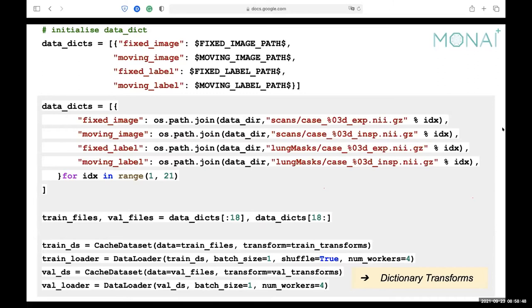We define our data dictionary by linking all the paths. You download the image dataset and link all components to their file paths. We divide our data into two components: the first 18 pairs are used for training and the rest for testing. We combine the data dictionary with transformations to generate our dataset. We use dictionary transforms implemented in MONAI, so the same transformations apply to both image and label — for example, during random affine augmentation, you want image and label to go through the same transformation so they still match.